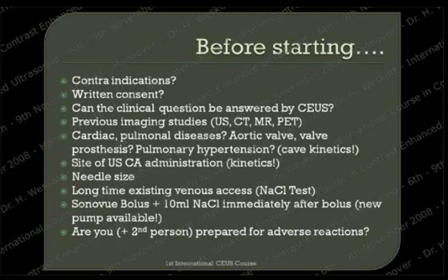One is for the contrast agent and one is for saline. When you activate the pump, you first get the contrast agent as a bolus and automatically afterwards the 10 ml bolus of saline. This is a new pump and it looks quite good, and you don't need a second person for the injection. So this might be the advantage.